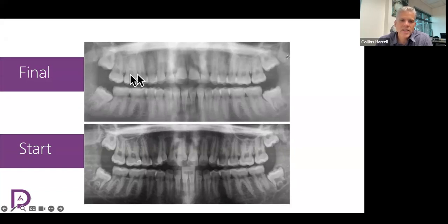In fact, remember how we distalized a little bit on the upper right side? It wasn't very much. It was like a millimeter. Okay. If I was distalizing more than that, I would have wanted that upper molar extracted, the upper 8. I would have wanted that extracted because I would want the recent extraction site with all that good cellular activity to allow that distalization to happen. But it was only a very small amount of distalization, so it wasn't really impacted by having those 8s present.